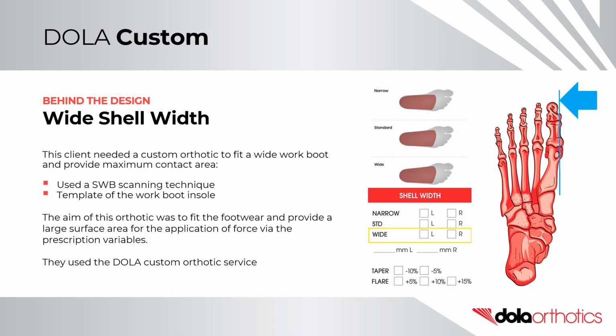The aim of this orthotic was to fit the footwear and provide a large surface area for the application of force via the prescription variables. They used the DOLA Custom Orthotic service.